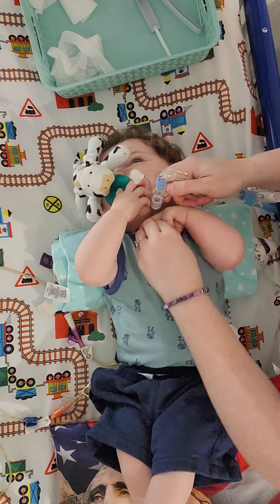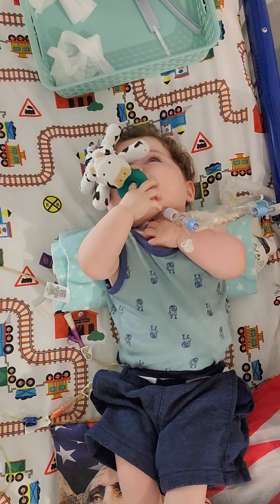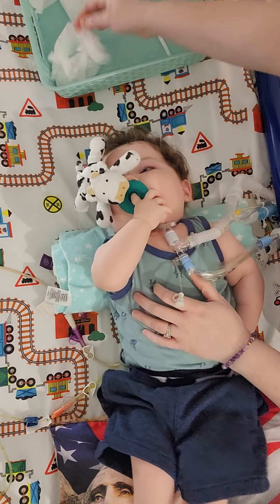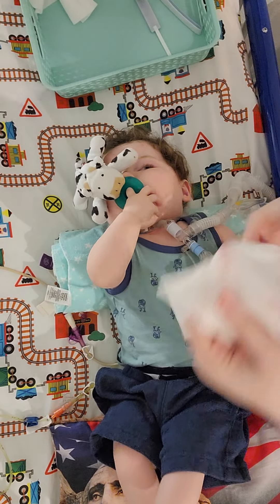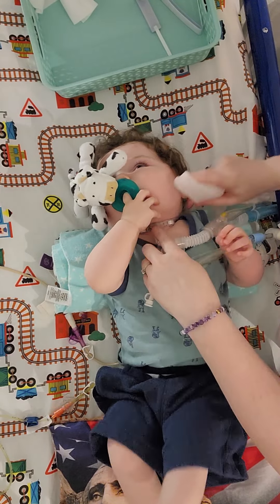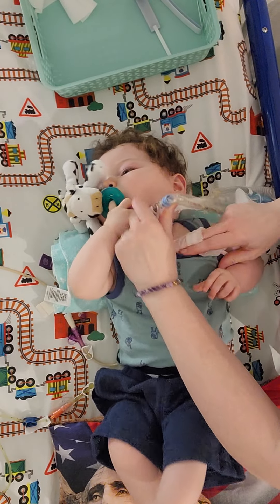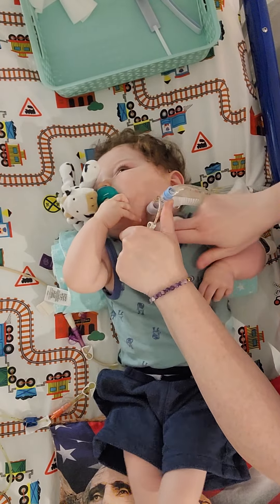First thing I'm going to do is take out this gauze, keeping his ties tied, and always look at it to see what color the sputum is. I have a body wipe — you could use a baby wipe — and I like to clean around the stoma while the ties are still tied when I'm doing it by myself, and even with a partner, because it's just safer.